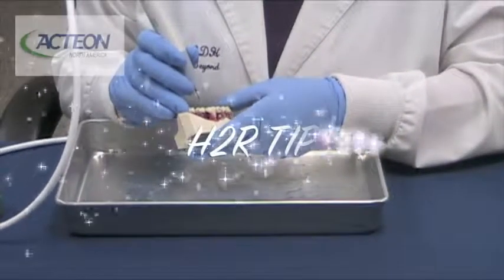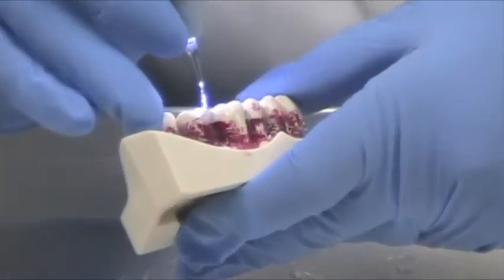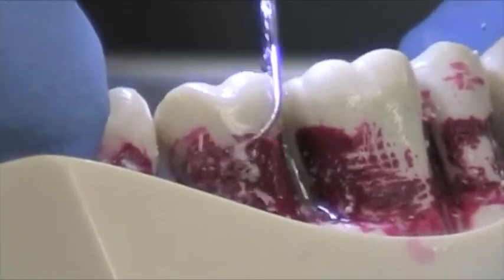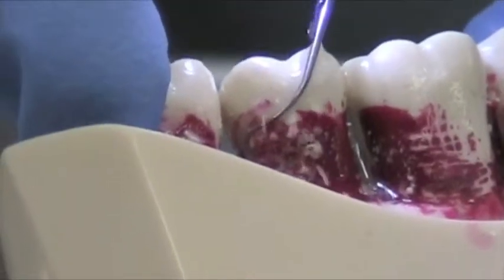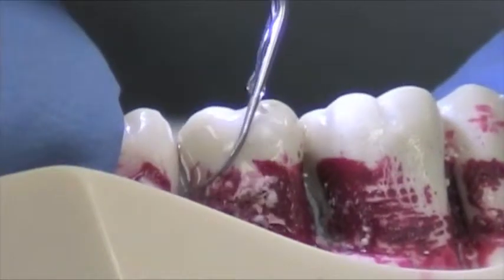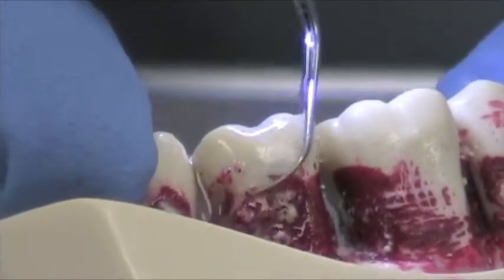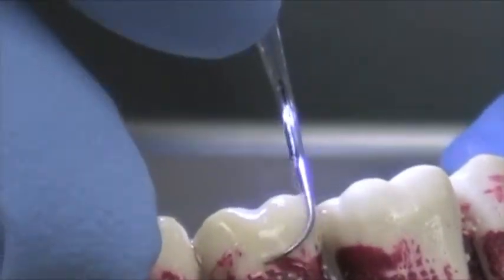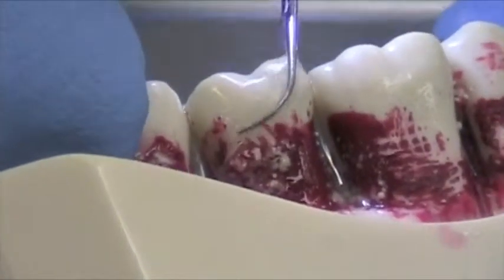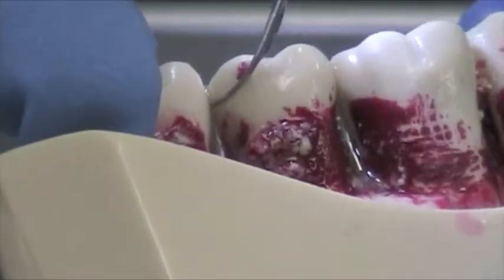Now we're going to demonstrate the H2R tip. The H2R tip is again a diamond coated tip used for the posterior teeth. You can see I'm on the buccal — kind of roll the instrument right into the lingual very, very lightly. You're doing conservative root planing and can remove burnished calculus. Very, very precise, light touch. It's an excellent tip, but you do have to be very methodical, slow, and precise.